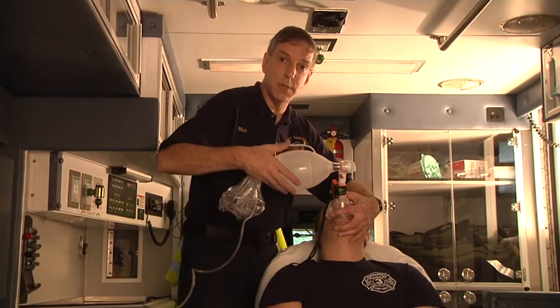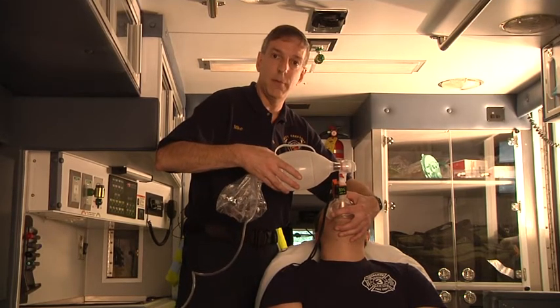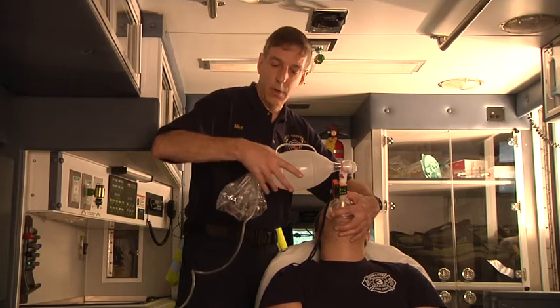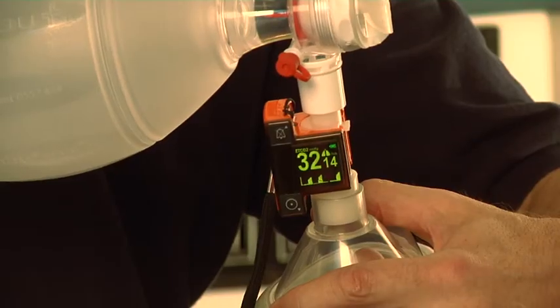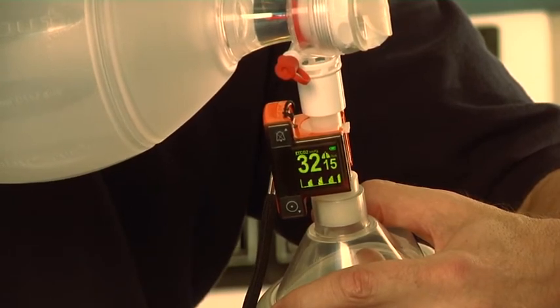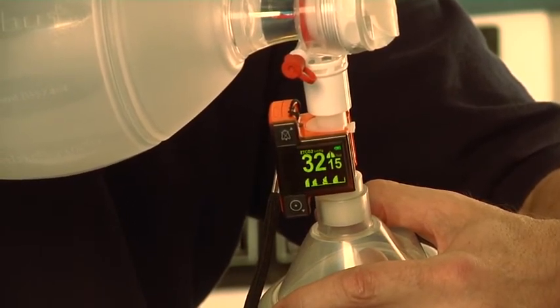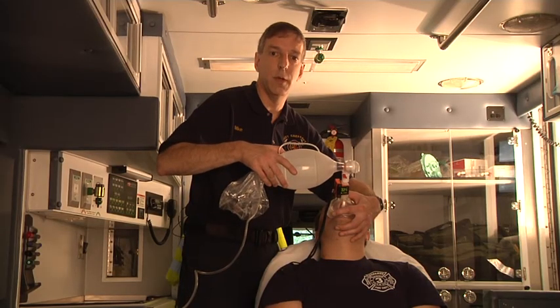If the patient's breathing spontaneously, holding the bag valve mask over their face allows them to draw 100% oxygen from the bag. You may need to adjust the flow of the oxygen so that the bag delivers 100% oxygen to the patient without totally collapsing with each breath.